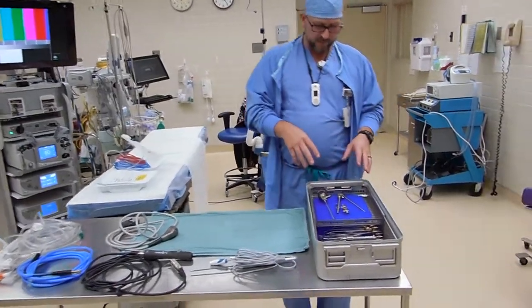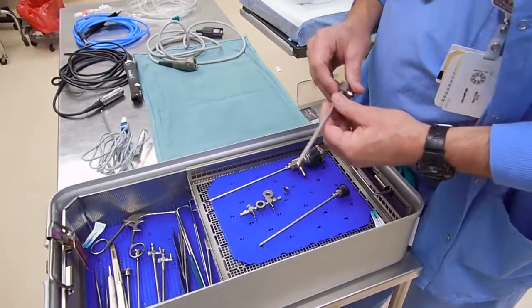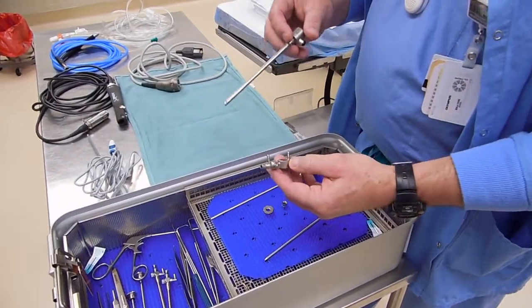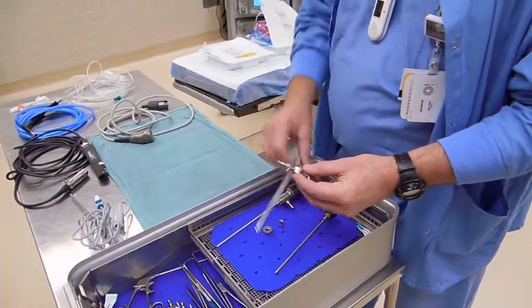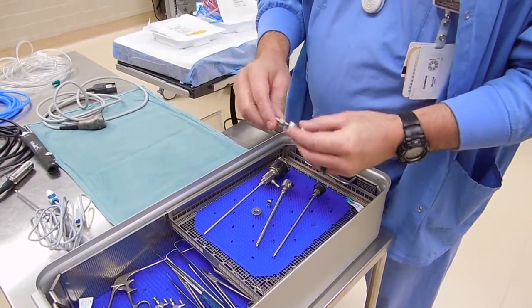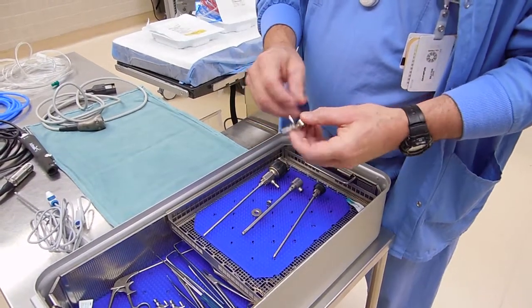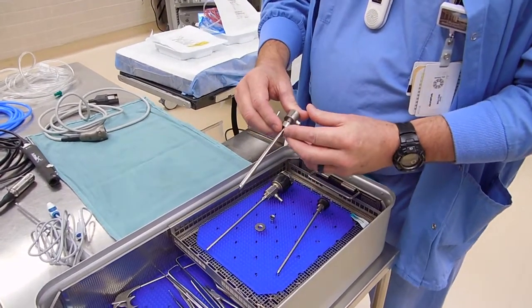One of the things you'll notice is that Arthrex's equipment is not built as one piece, so it comes apart. This can go either way — you can flip these up or down, it will work either way. Our surgeons prefer that they open and close towards them when they're operating, so we put it on the obturator this way.